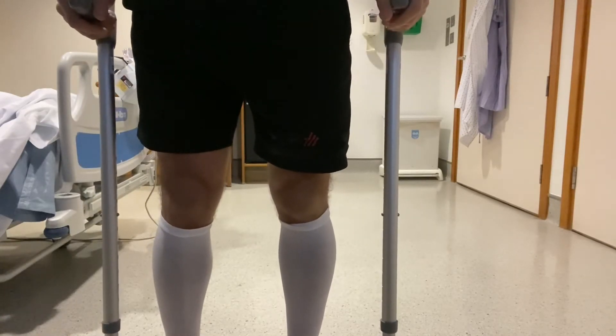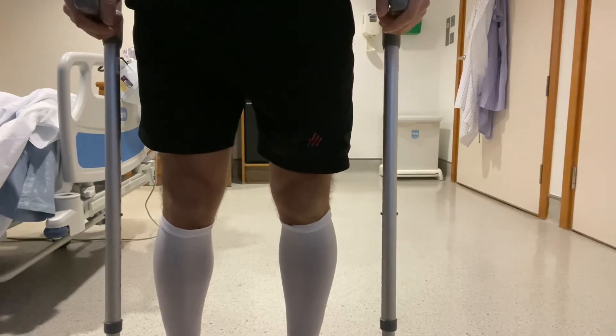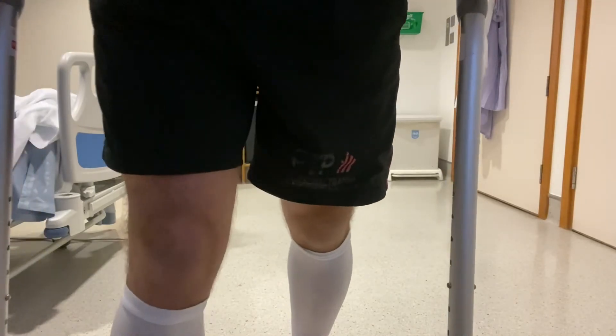If this feels too challenging, go back to the simpler method of bringing the crutches forwards and then follow that by the operated leg. So let's take a look.